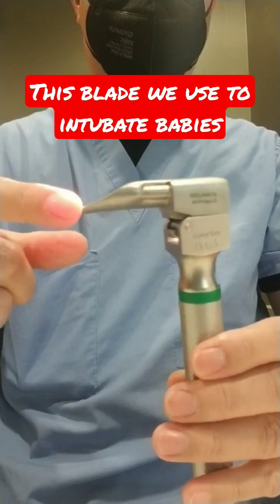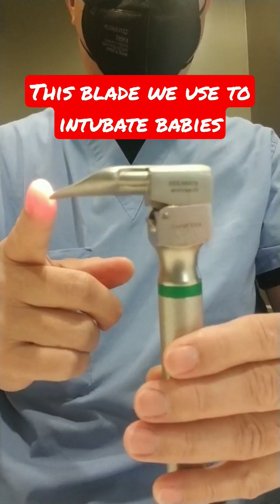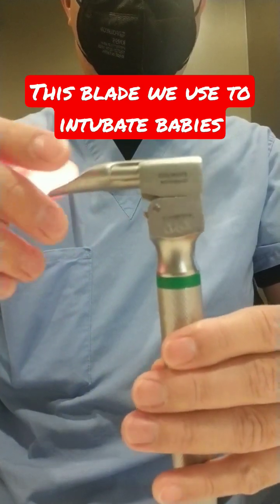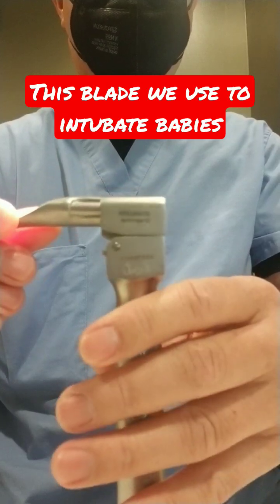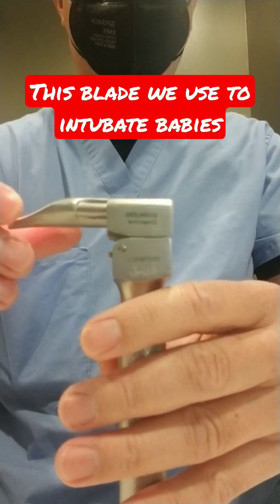This is not sharp — it might look sharp, but the tip is blunt. We are very careful when putting this inside the baby's mouth, because even if you're careful, there can be some trauma or injury in the baby's mouth.